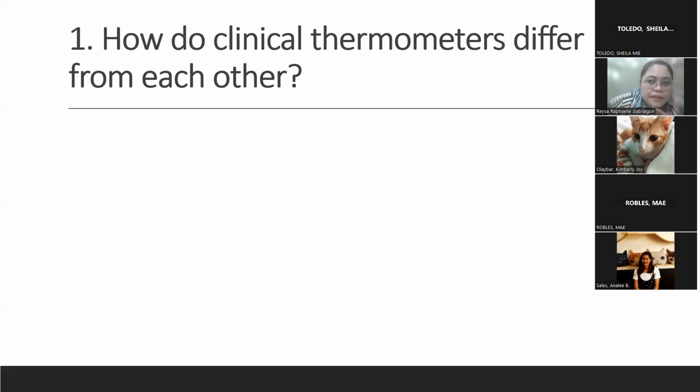So, mahirap yun, especially pag nabasag yung thermometer. And remember that mercury is included in our volatile metals. Nag-volatilize sila even at room temperature. So, even if you don't hold the mercury during spillage, pwedeng mapunta pa rin siya sa body natin.